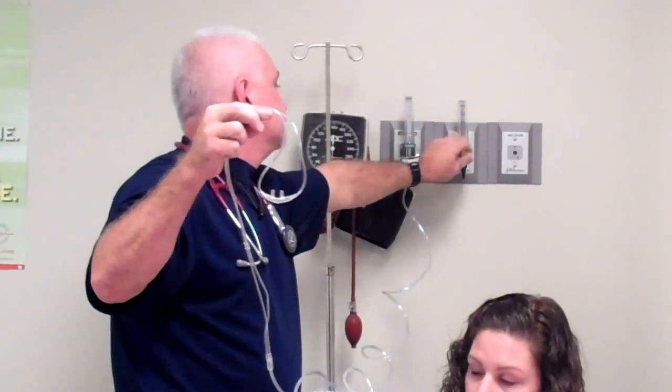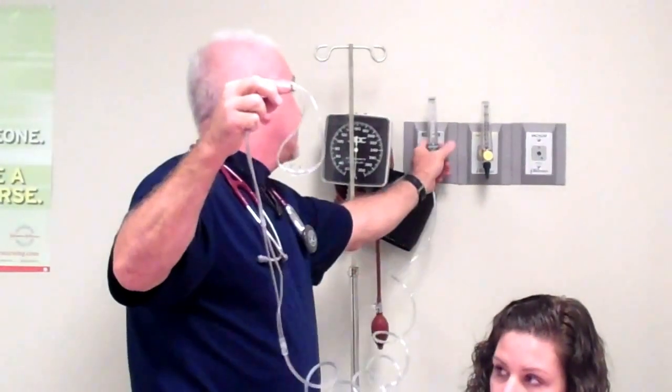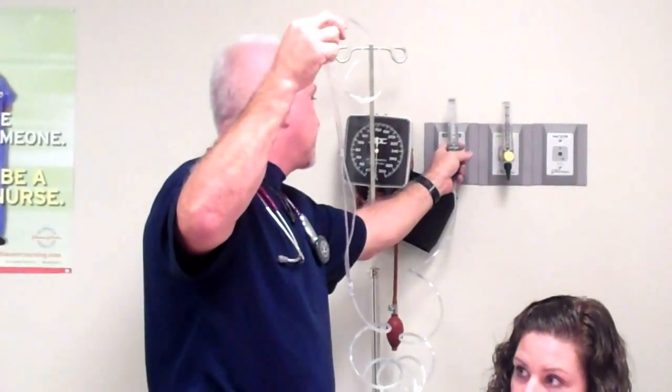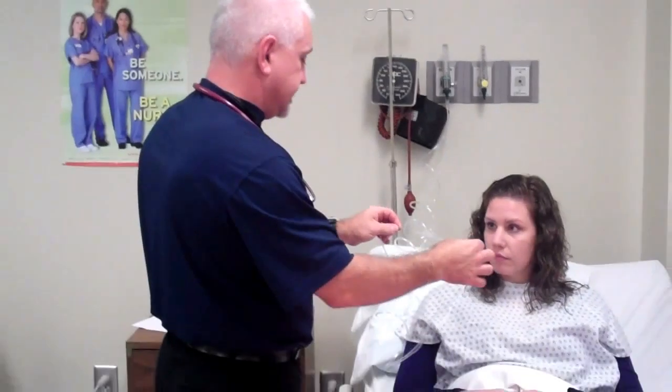And I check. Actually, I'll use the oxygen. And I check and make sure that it's working, and it's working at 2 liters per minute. And I turn it back off. I show the patient the nasal prongs and the nasal cannula.